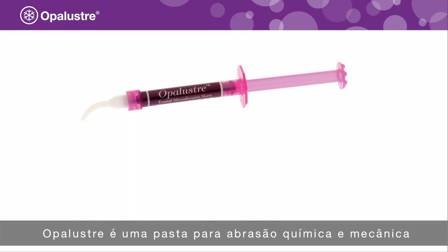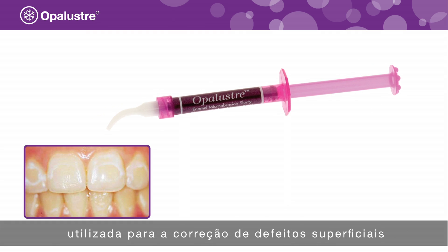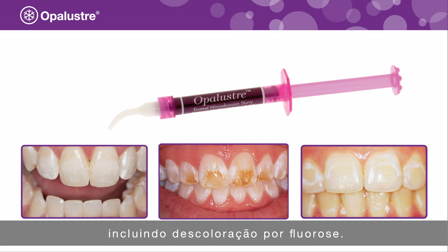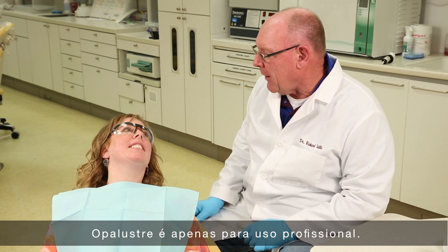Opal Luster is a chemical and mechanical abrasion slurry used for the correction of superficial white, brown, or multicolored enamel defects, including fluorosis discoloration. Opal Luster is for professional use only.